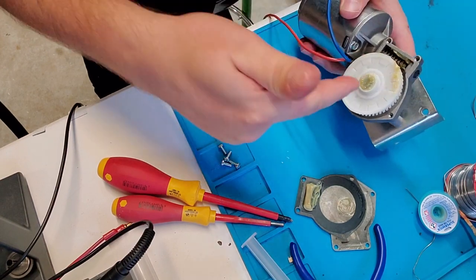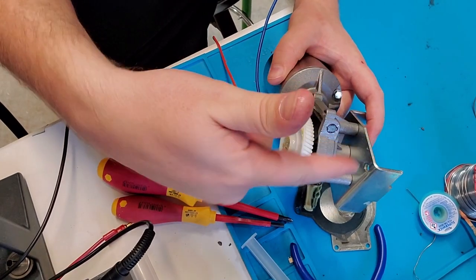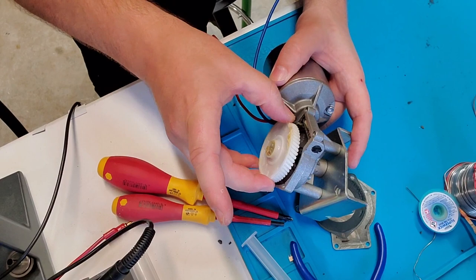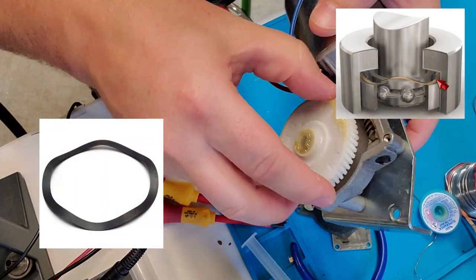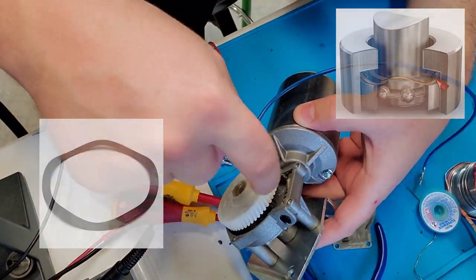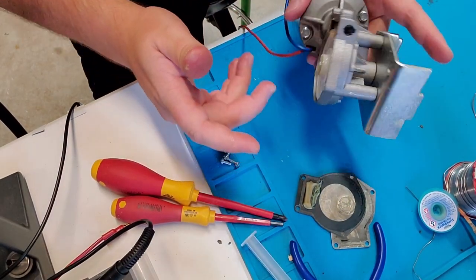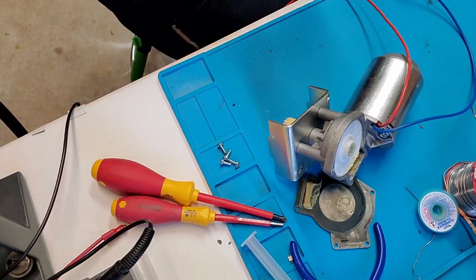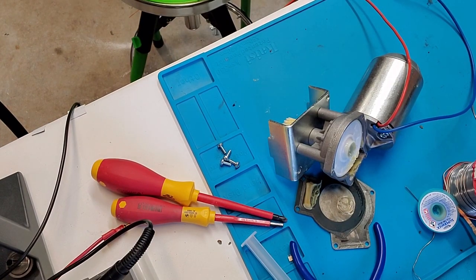It just has a bunch of grease on the backside of it. The bearing for the housing actually feels pretty good. Or it's a bushing rather, on this one. Oh, I do see a preload washer up in there, way up on the inside. I don't know if I can get enough light up in there to show y'all, but there is a little preload washer up in there. So this guy is spinning absolutely fine. Let's go ahead and pull the motor apart so that y'all can see what the motor looks like.